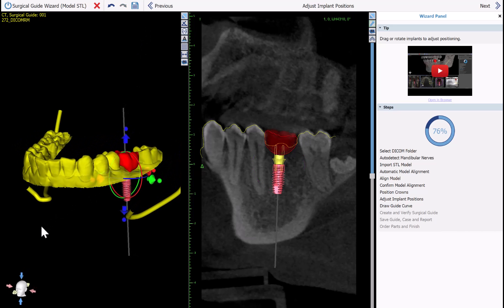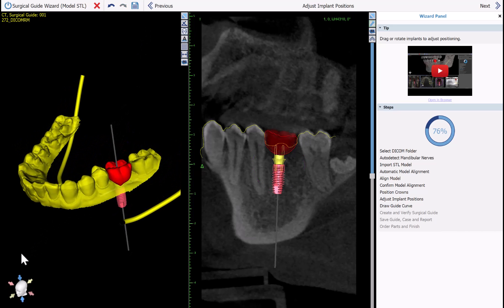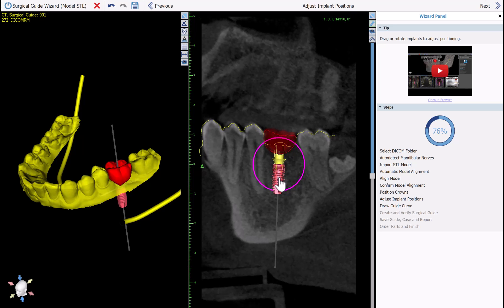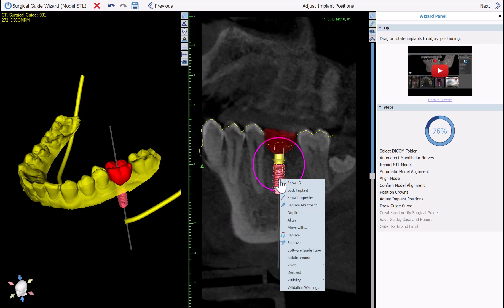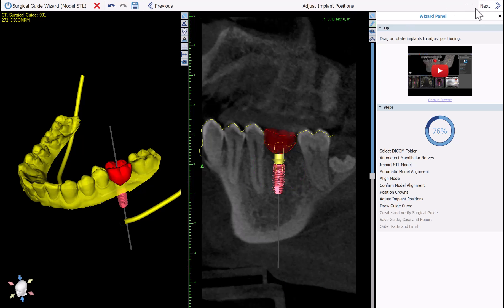We can see the implant placement in the 3D view as well as in the 2D view. You can make any modifications using your left mouse button — just grab and drag the implant accordingly. You can rotate using the widget and your left mouse button, tilting the implant mesial or distal. If you'd like to change the size of the implant or abutment, simply right-click and choose Replace Abutment or Replace, then select the relevant implant or abutment. Once done, simply click Next.